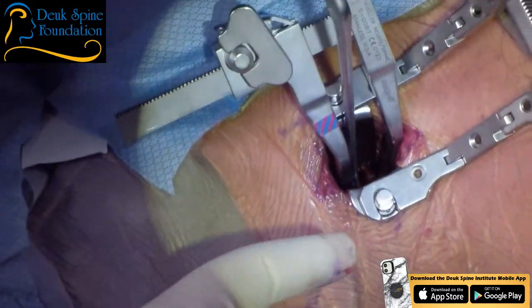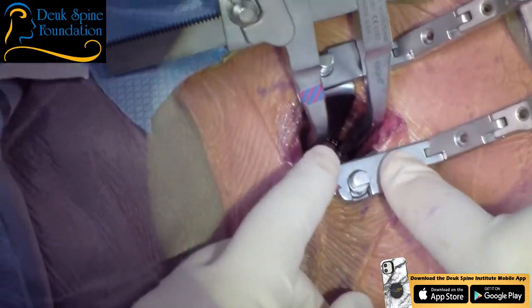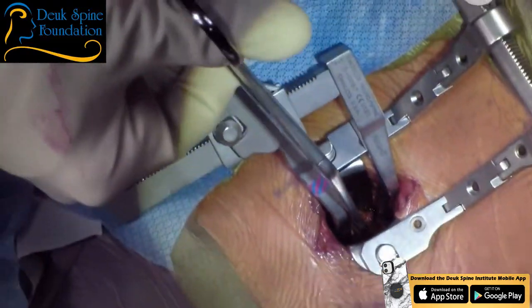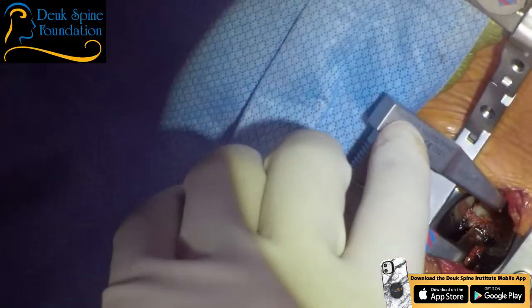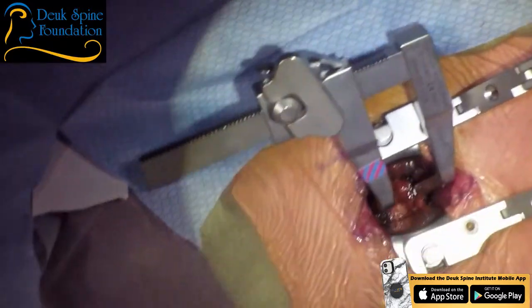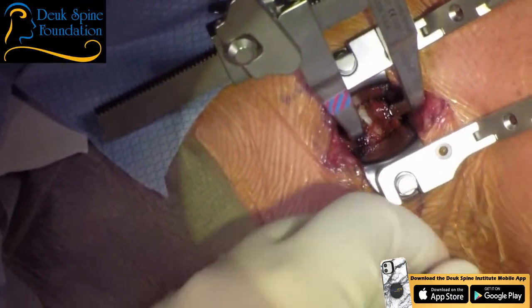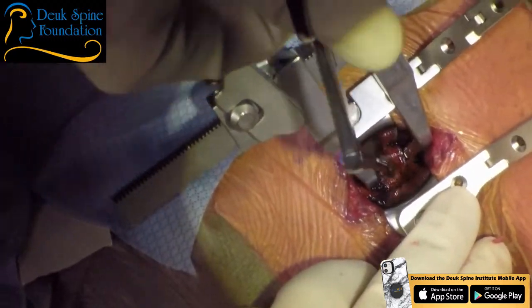The other thing you get a lot of knockoffs of is this retractor. For ACDF, it's the best in the world. What is this called? It's called a Caspar retractor. And we buy this system, I think it's from B. Mueller. It's German, the best in the world. No substitutes.